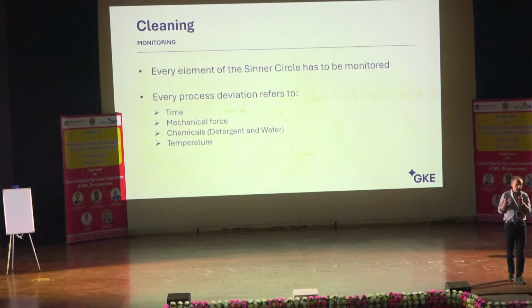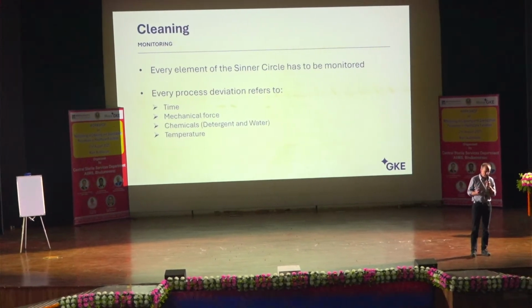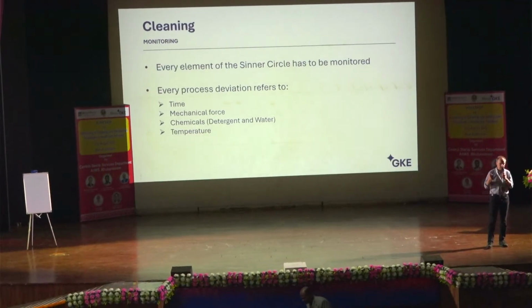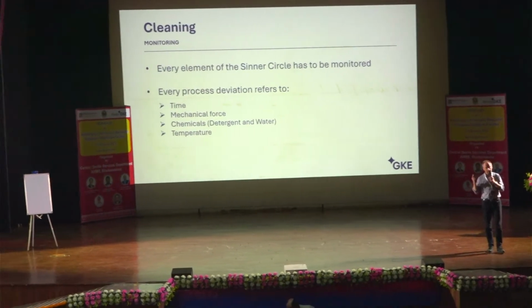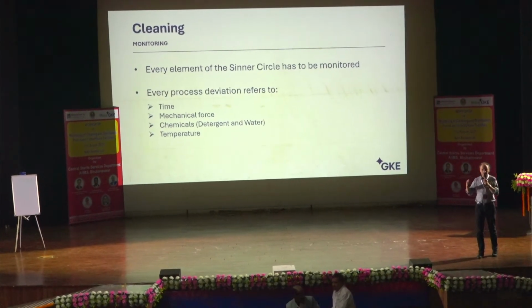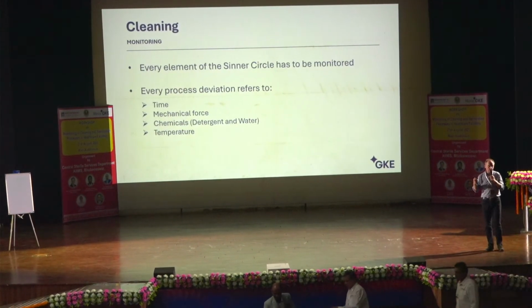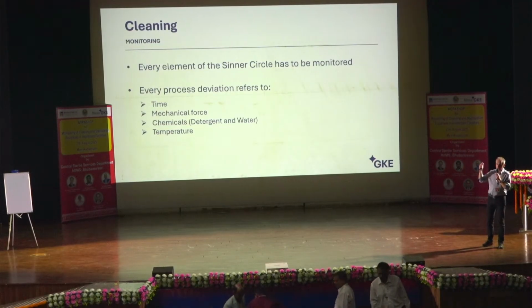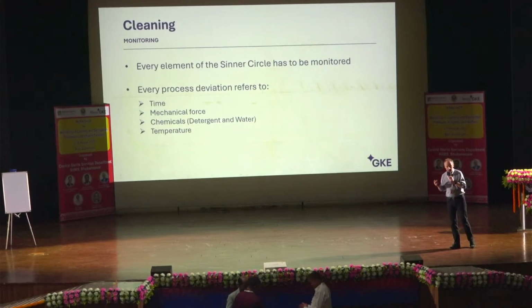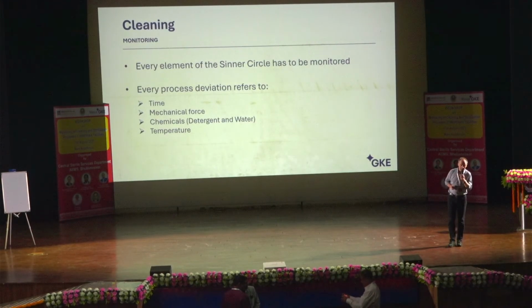In the first part we talked about the components of a cleaning process. We talked about the impact of the medical devices, of the contaminations, and we have seen that the combination of water quality, of temperature, of detergent, all this has to match in order to get a decent process.